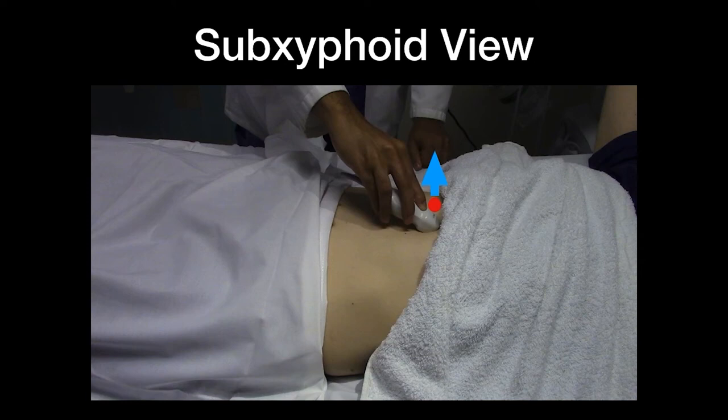To obtain this view, we need to direct the sound waves underneath the xiphoid process and into the chest. Start by fanning upward towards the patient's head. You will also likely have to make a slight adjustment aiming your sound waves towards the patient's left shoulder. Occasionally, this image will be difficult to obtain due to patient's body habitus and protuberant abdomen. Having the patient take a deep inspiration and hold it may assist in bringing the heart closer to the probe and making the subxiphoid image easier to obtain.